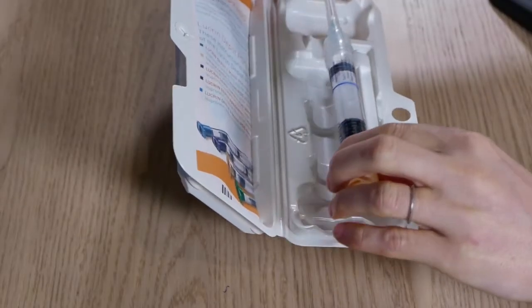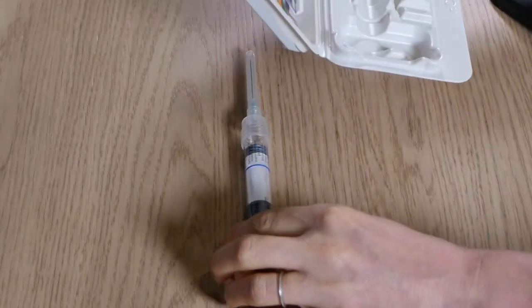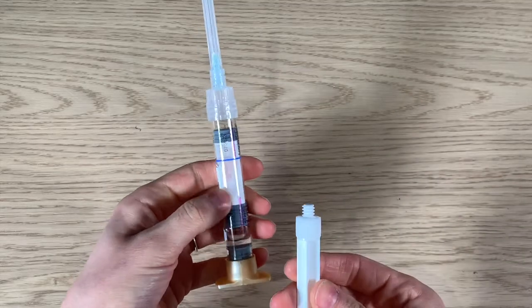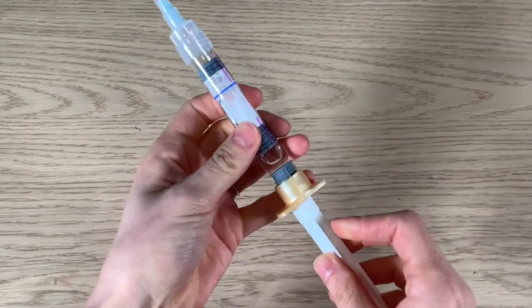Aside from the instructions, the box contains a pre-filled syringe and a plunger. The plunger needs to be screwed into the syringe.